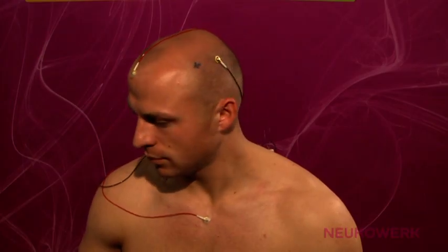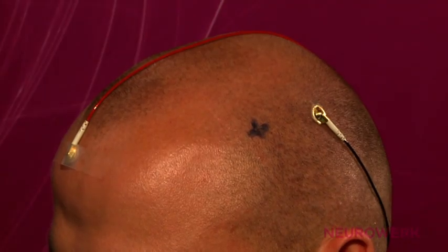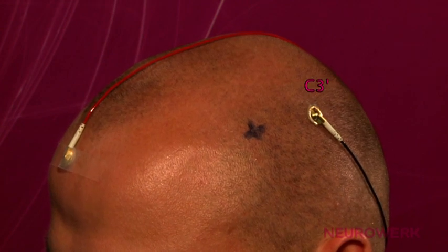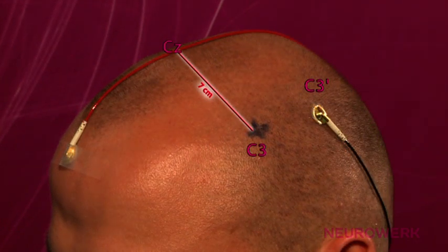In the 4-channel SSEP recording of the median nerve, 4 different or active electrodes, in this instance with black cables, are used. The C3' recording place, which is on the opposite side to the C4' place, results from the basic statutes of the International 10-20 system and corresponds to channel 1. Starting from the Cz central point, it should be measured 7 cm to the temporal to determine the C3 point. From the C3 point, it should be measured 3 cm to occipital to receive the C3' recording place.